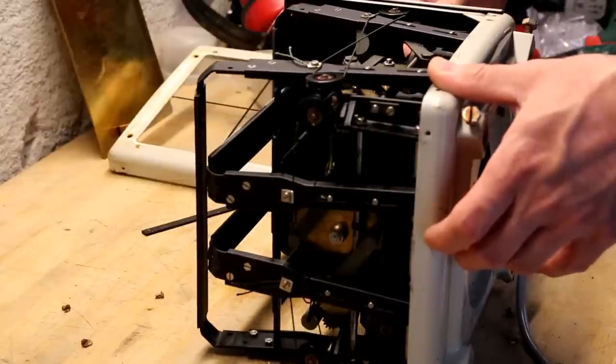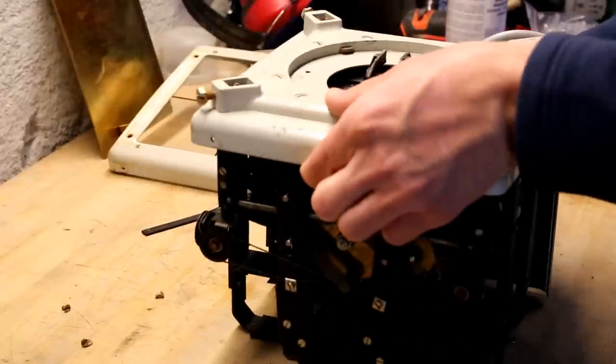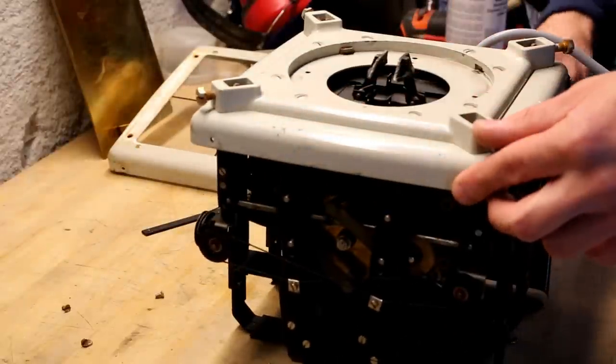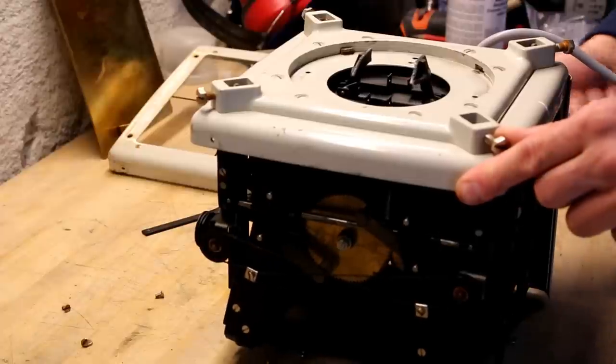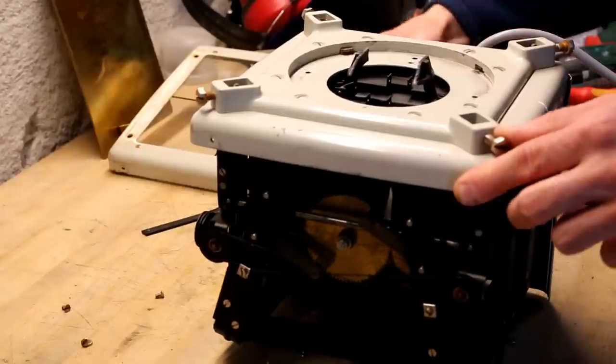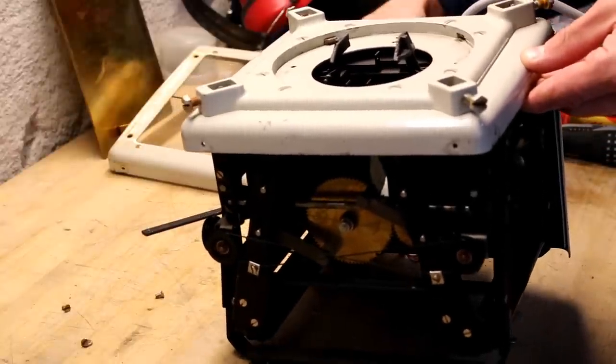Yeah, but that's basically the principle of a collimator. It can shift. Oh, here we can see how it turns in and out the underside. But then the other one, okay, it just has a few plates.